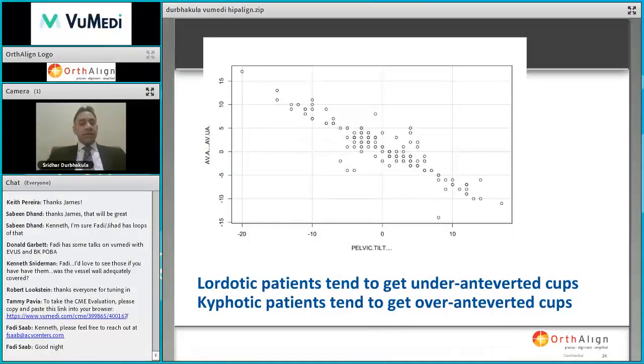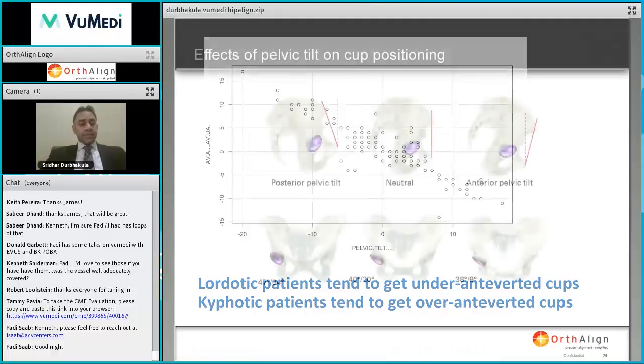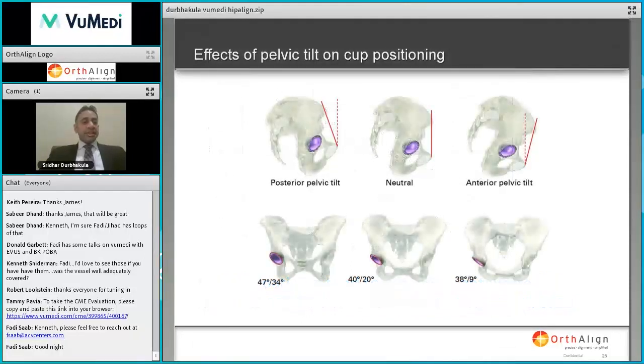The punchline to take away from this, and we all know this, and there's multiple papers that have looked at this over the last several years, but lordotic patients get their cups under anteverted, and kyphotic patients get their cups over anteverted. And I think with HipAlign, we're eliminating those outliers. And this is just an example of what we're seeing here and the differences of pelvic tilt and how much variation they can have on abduction to a lesser extent, but certainly on anteversion, and that's well documented.